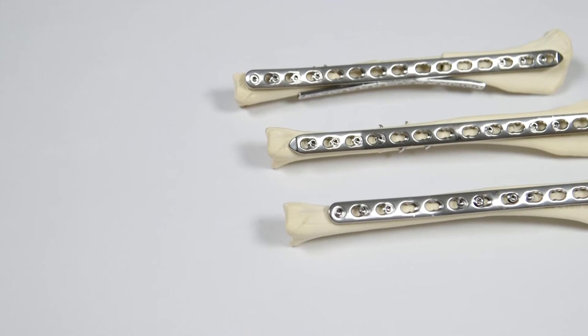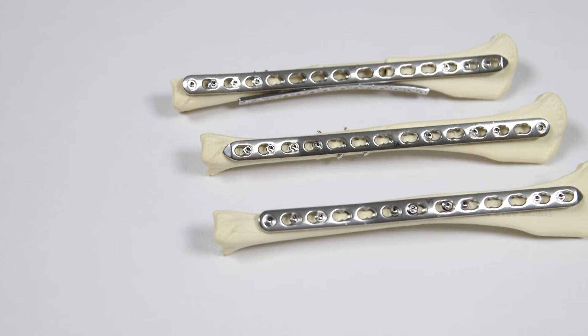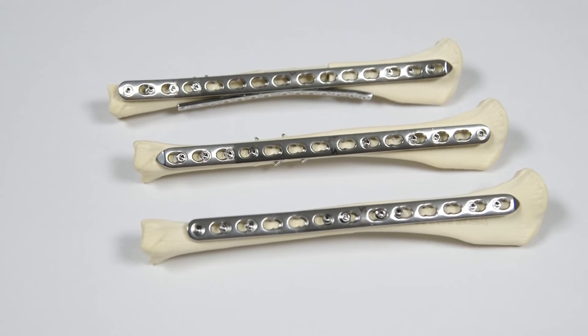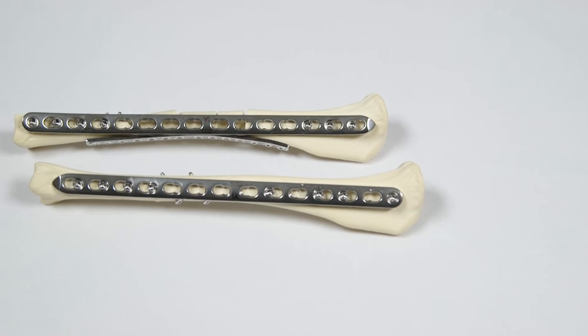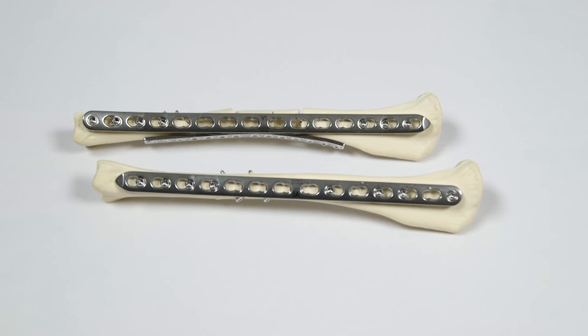Locking technology offers a very secure plating construct. The threaded screw heads lock into place in the threaded plate holes, creating a rigid, angle stable construct. Where axial compression is not appropriate or achievable, the DLP can be used in purely locking mode as a neutralisation or bridging plate.